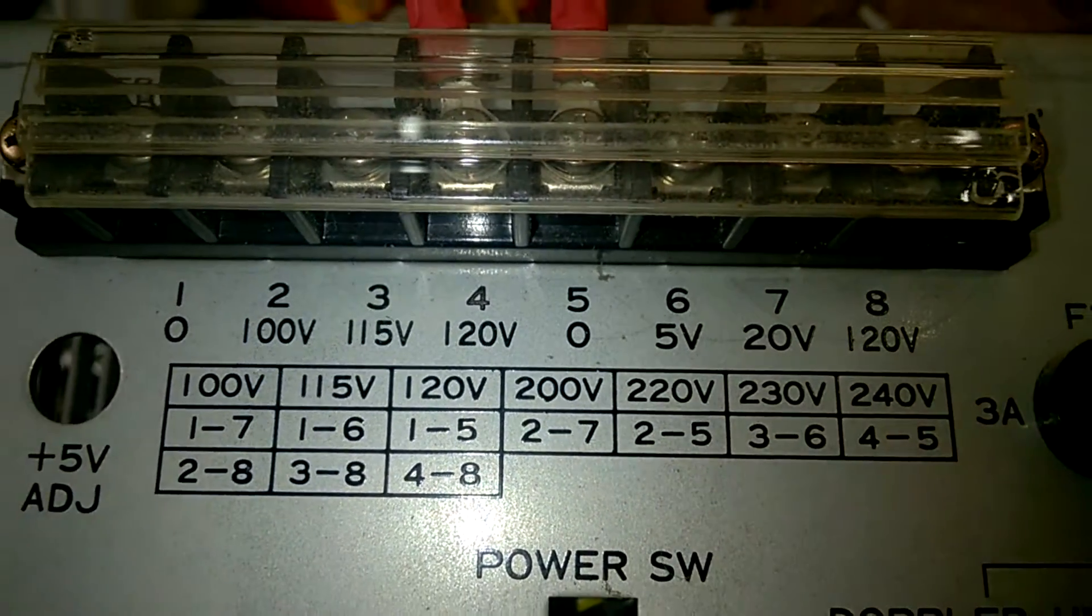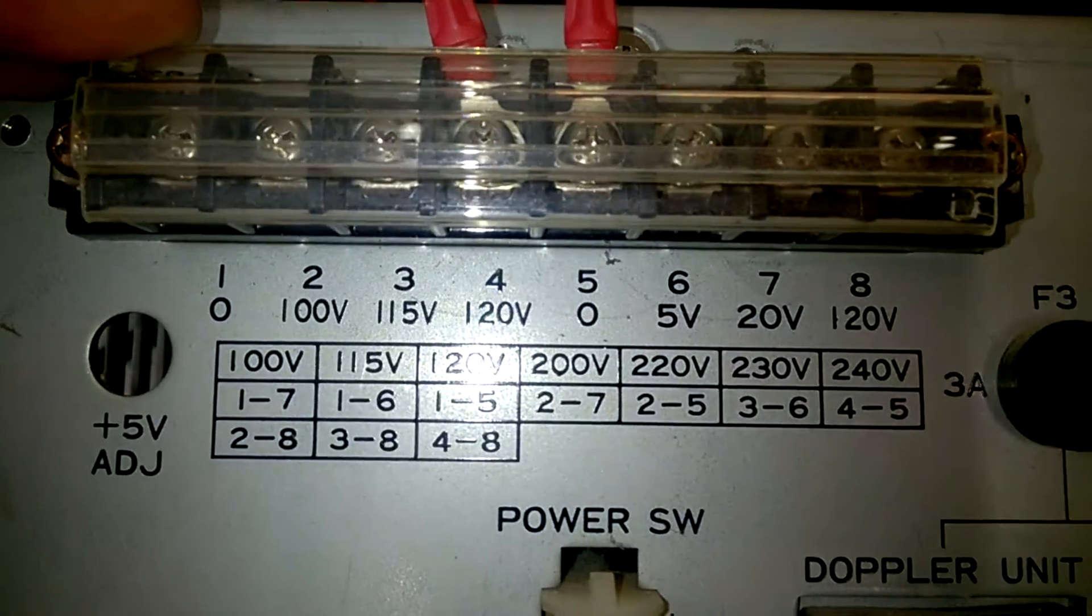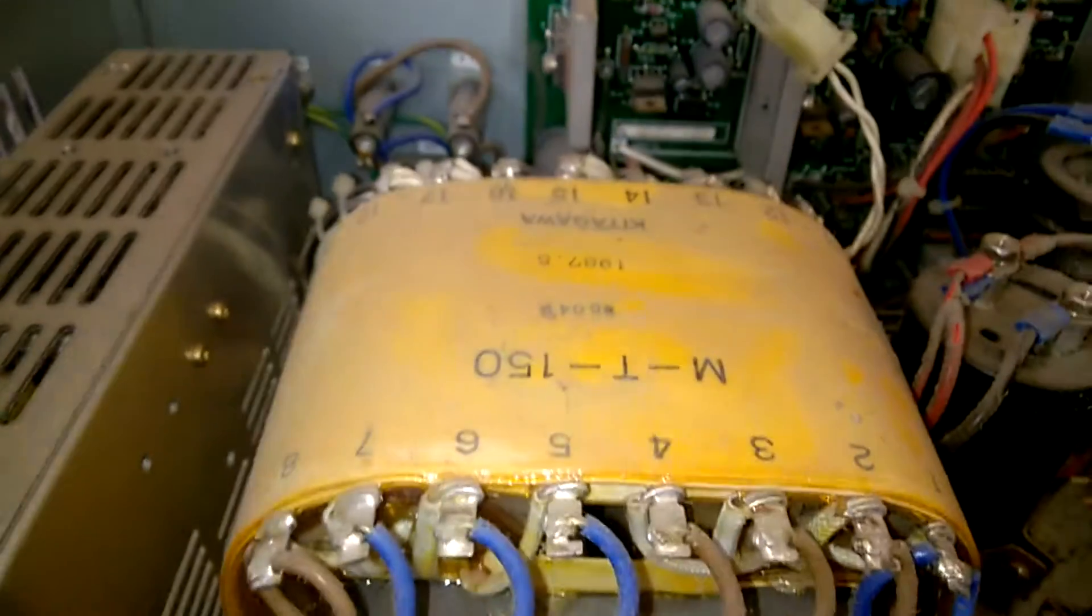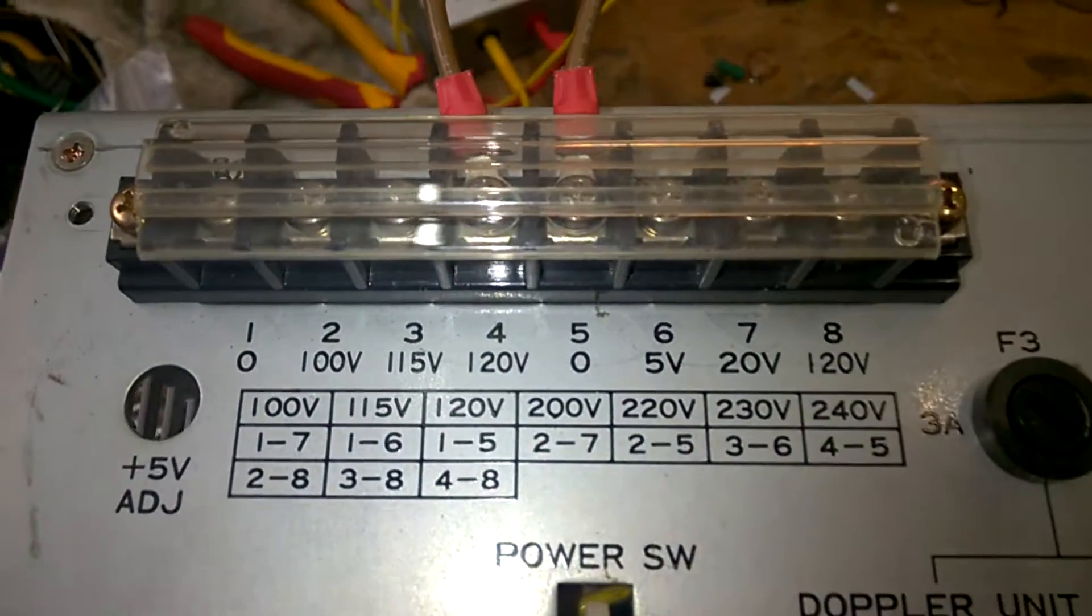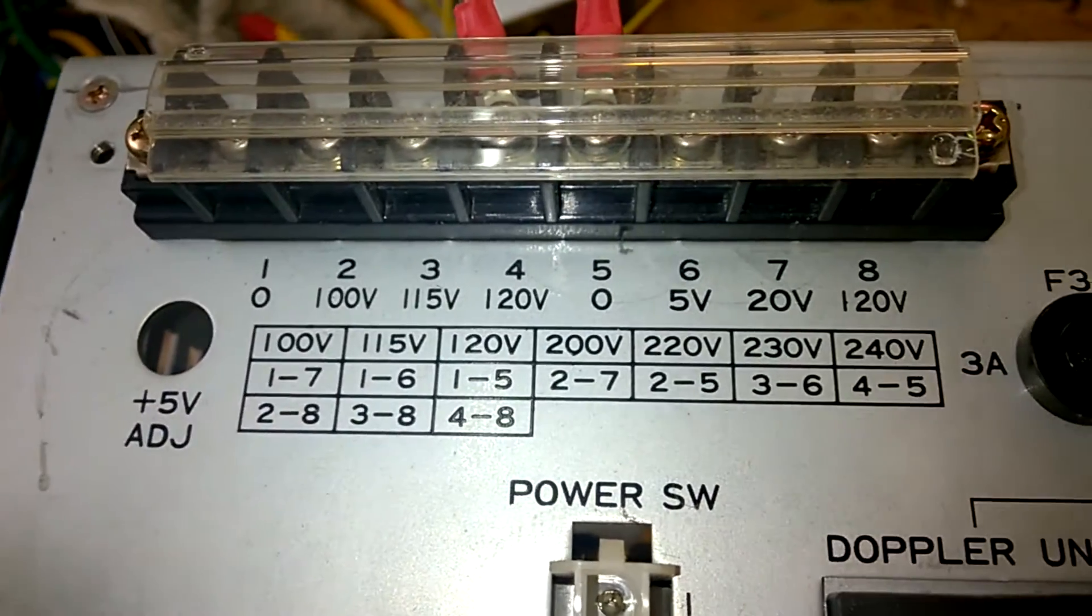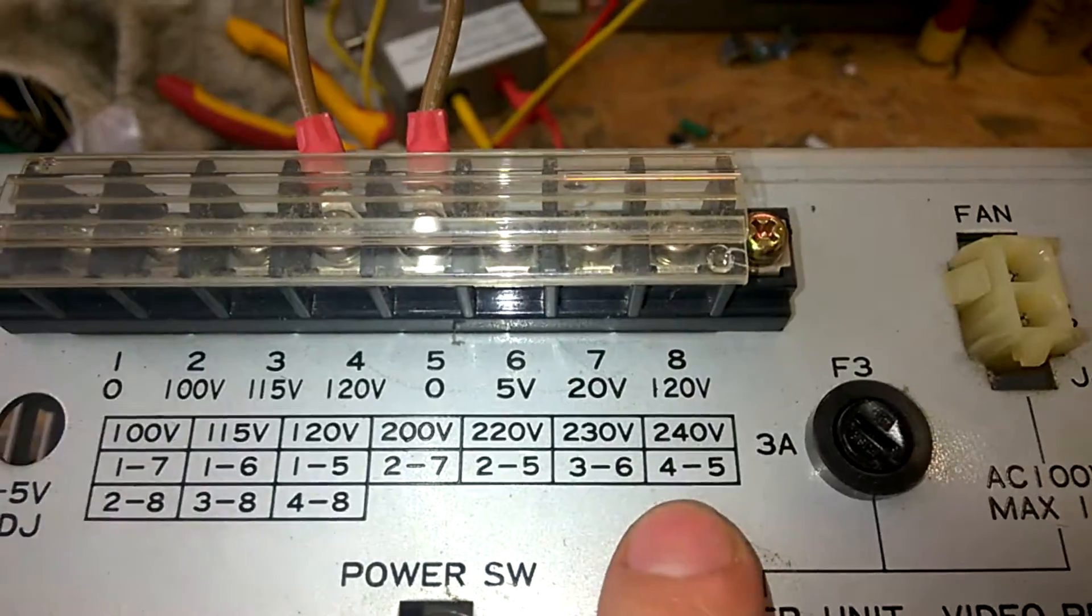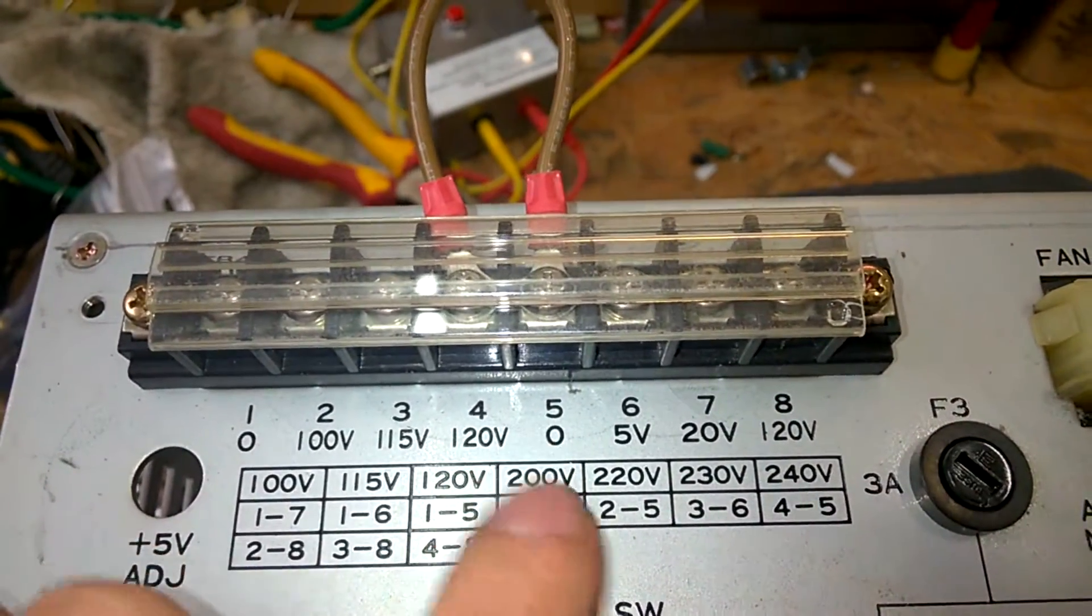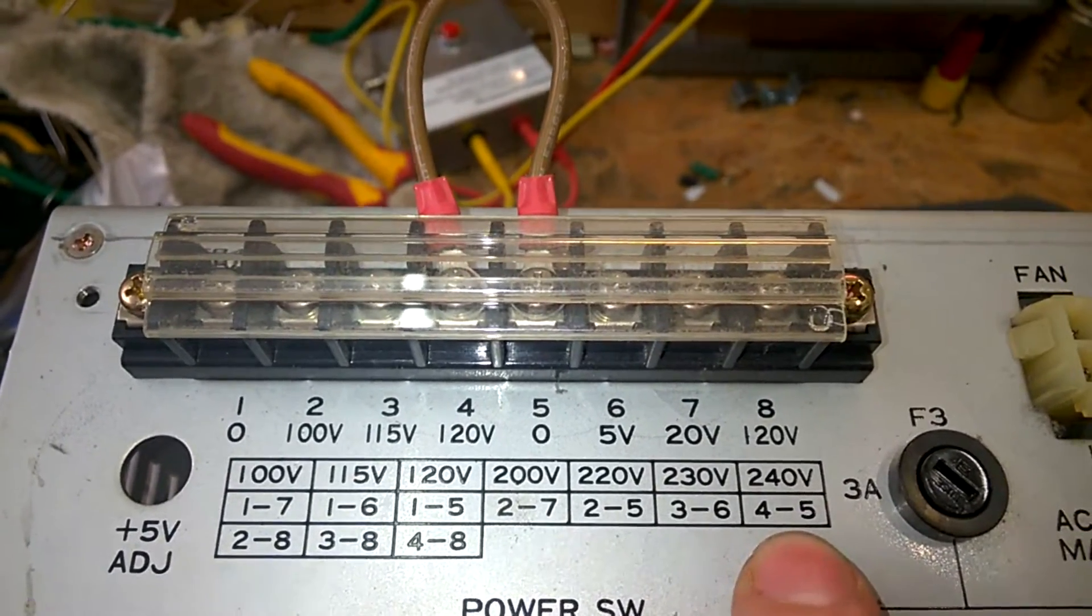The primary inputs. The numbers here are exactly the numbers here, and it shows you how to connect it for the different voltages. Here in Austria we have 240 volts. So I have wired it this way, 4 and 5, that's the wiring for 240 volts.